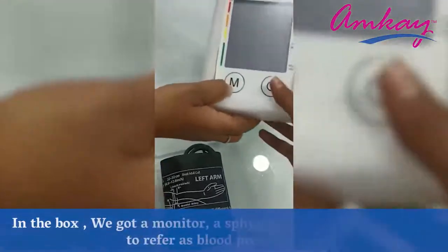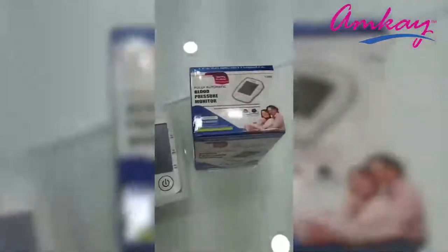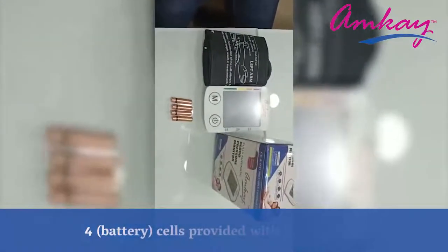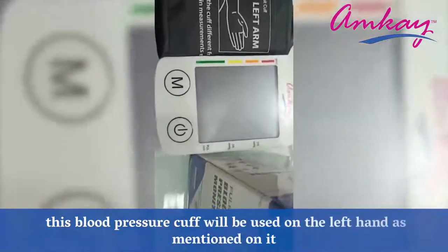In the box we got a monitor, a sphygmomanometer which is referred to as a blood pressure cuff, and 4 battery cells were provided with this machine. This blood pressure cuff will be used on the left hand as mentioned on it.